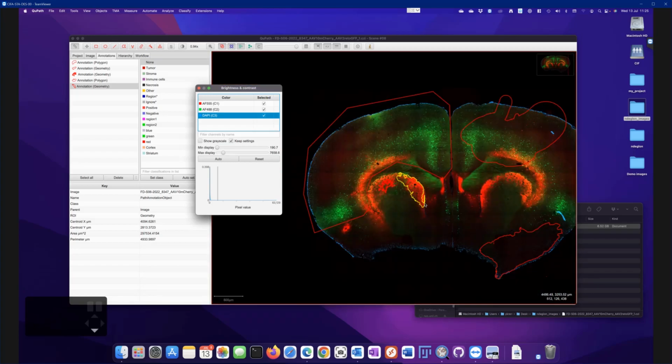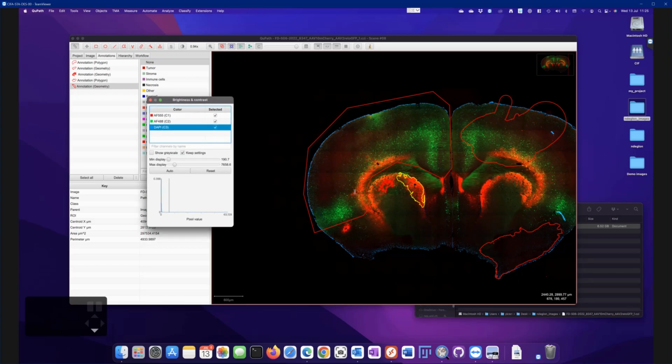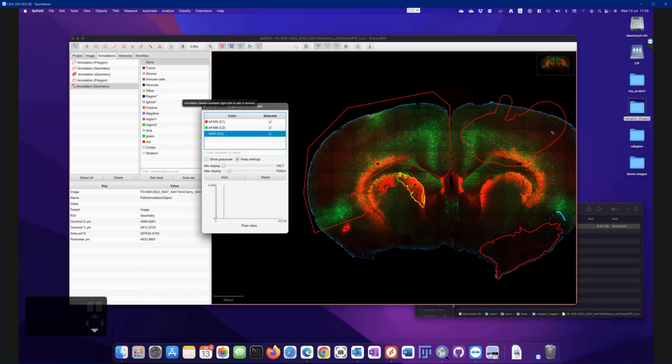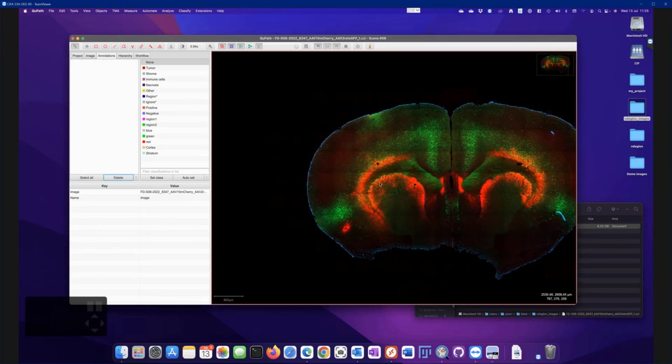There's also another useful thing, which is to use some region arithmetics. Let's say you have something that you want to design with the brush. So what I will do here, just close this panel for getting a bit more real estate. I will delete all those annotations here and try to draw the cortex part correctly. And I will show you how to use the annotation arithmetics.